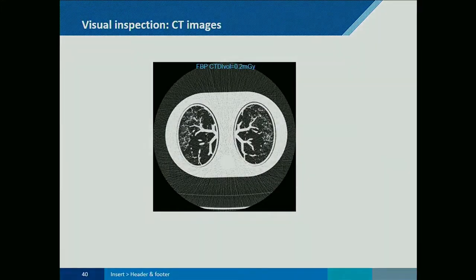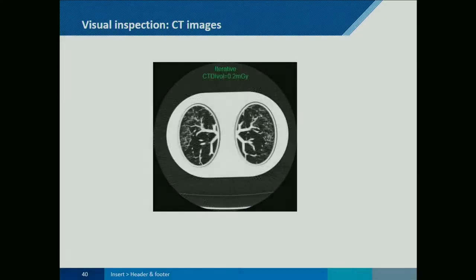And this is what images of the phantom look like when you actually put them in a scanner. This is for filtered back projection at extremely low dose. You can see that there are plenty of artifacts and also that the vessels are rather blurry. This is with iterative reconstruction, because reconstruction has advanced a lot. Then I'm curious if Marta has scanned something in modern CTs, because it changed a lot and now we don't have screen film anymore, thank God.